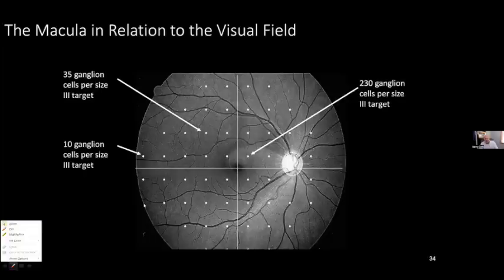And Dr. Fanelli, you showed us that the 24-2 may not be good enough for early glaucoma, because there are not enough points really. So are you saying that 10-2 would be better? I think studies seem to indicate, and a reasonably large study about 18 months ago was published showing, that about 50% of patients who have early glaucoma seen on structural change fundoscopically and on OCT do not show a visual field defect on a 24-2, but do show a visual field defect on a 10-2 that matches the structural changes. And that is strictly in the early glaucoma patients.